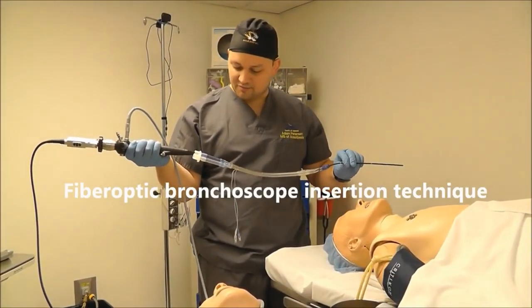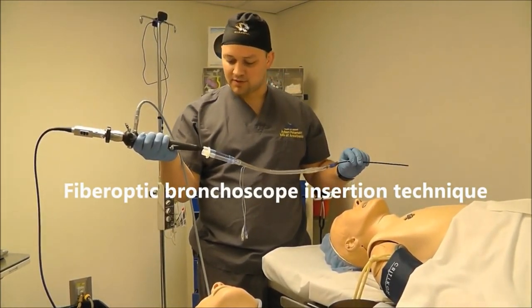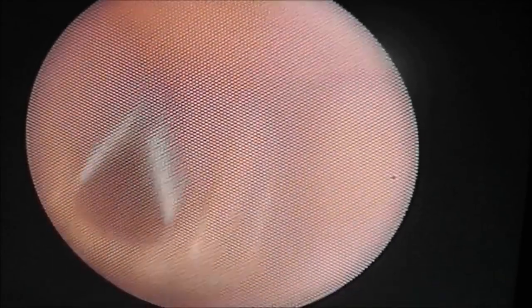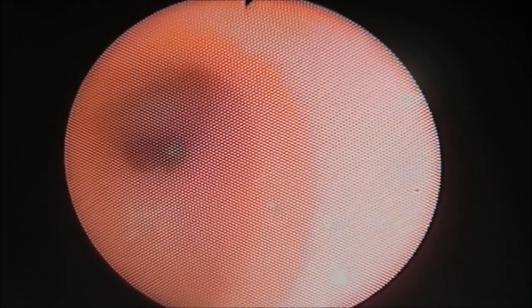The other method of placing a double lumen tube is by using a fiber optic bronchoscope. When you place the double lumen tube, you want to place the fiber optic scope through the bronchial lumen. Once at the uvula, advance the scope. Once you see the epiglottis, flex your tip upward and advance towards the glottic opening, down into the left main stem. At this point, you can advance the tube over the scope into the left bronchus.